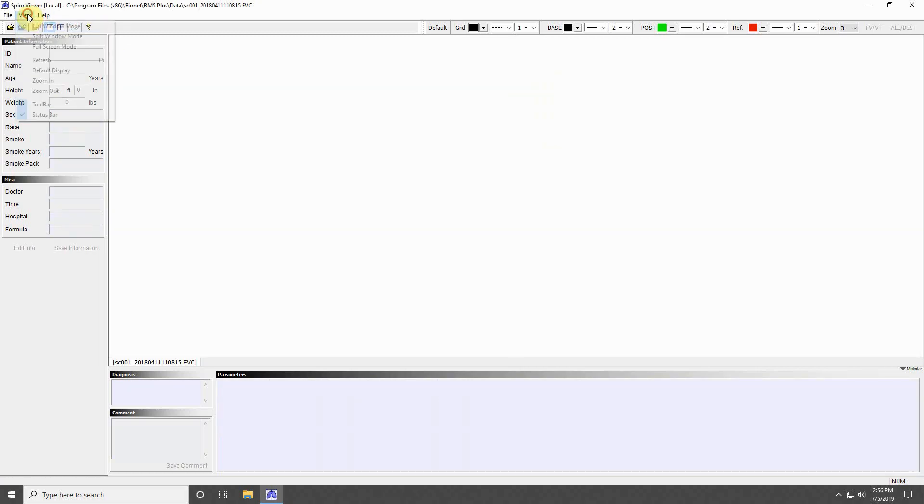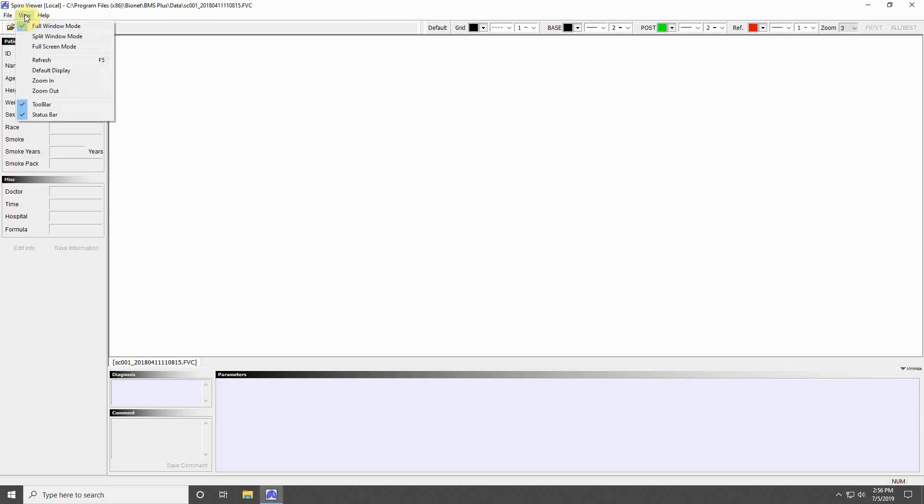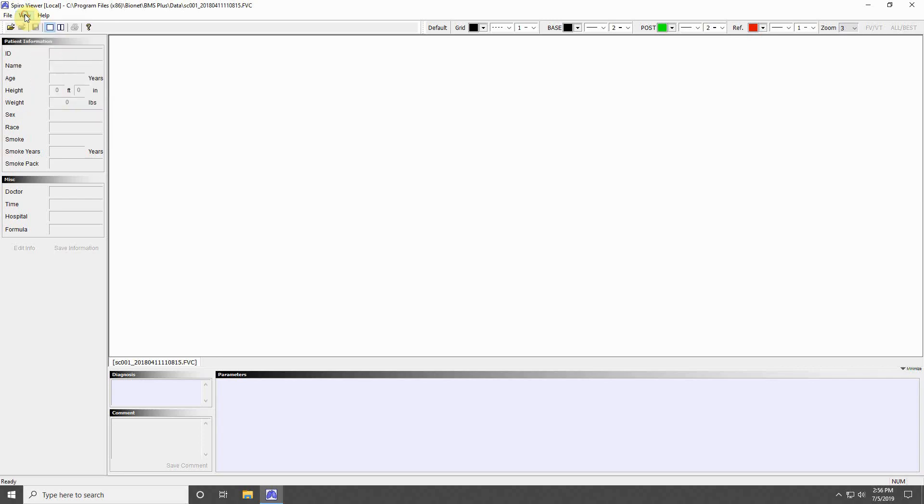The last viewing mode is Full Screen Mode and you can exit this mode by pressing Escape on your keyboard. The remaining options in the View menu allow you to zoom in or out, pressing Default Display to undo all changes, and to select which toolbars are visible in the program window.